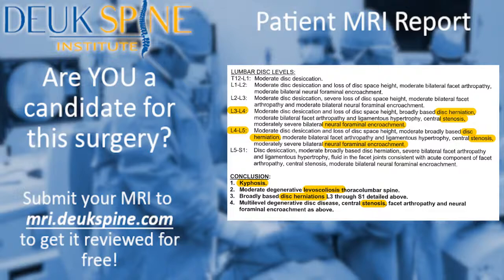Okay, thank you for sharing. So go ahead and take a look at the screen, and you'll see the MRI report, and the MRI report will show you what this patient has. Very common problems: degenerative disc disease, herniated disc, bulging disc, stenosis. But they also have scoliosis and kyphosis, which is deformity of the spine. We're not fixing that today. We don't need to, because they're not causing pain.